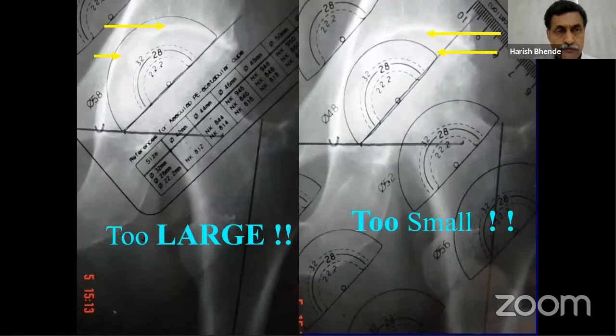This is just an example showing that a 58 cup in this particular acetabulum will be too big because it is removing too much of the bone, and the smaller cup will be looking very small.